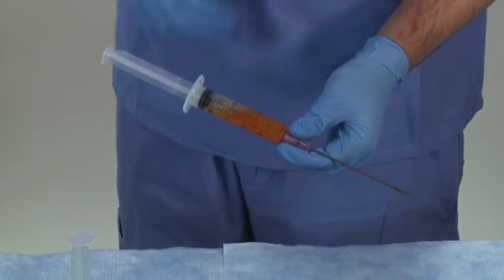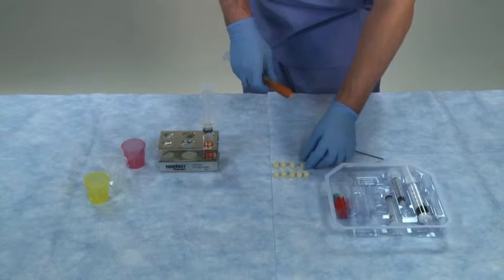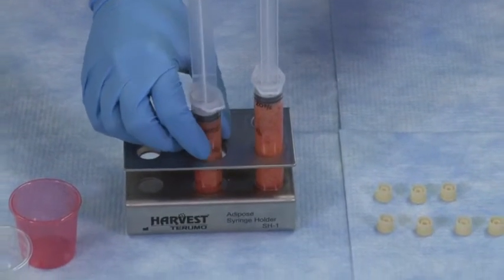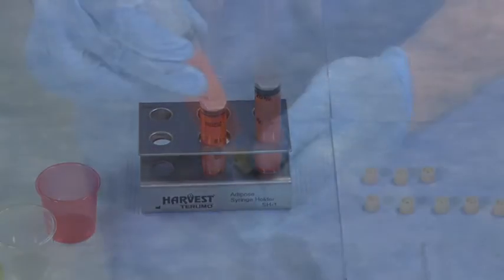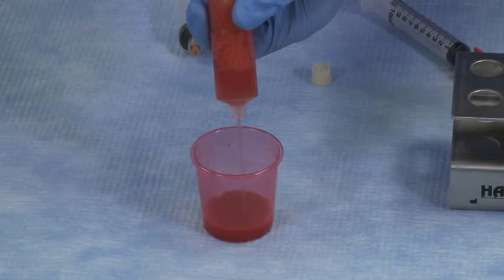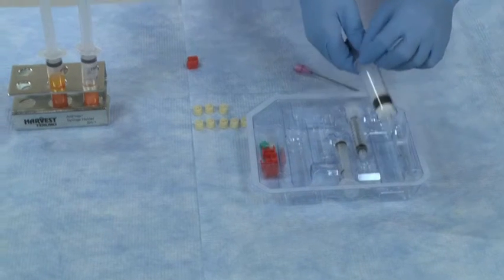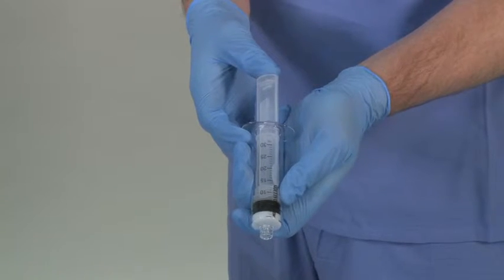Once each collection syringe is filled with lipoaspirate, replace the harvester cannula with a tip cap on the end of the syringe. With the tip cap facing down, place the syringe vertically into the decant rack and allow the lipoaspirate samples to stand for at least one minute. The infranatant fluid will settle to the bottom of the syringe. Expel the separated infranatant fluid out of each sample syringe into a disposable cup. Prior to transferring lipoaspirate to the process disposable, be sure that the disposable plunger is completely depressed and flush with the lipid barrier disk at the bottom of the syringe.